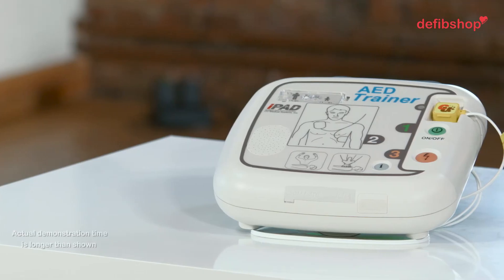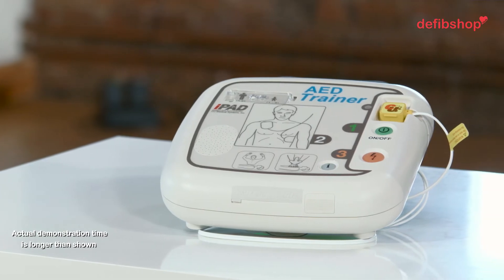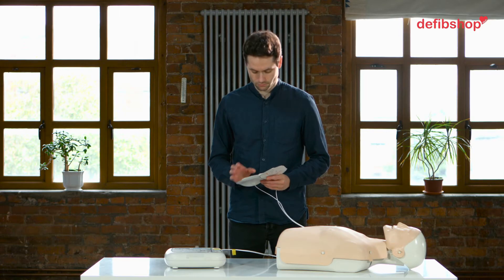This is a training unit, but here's how you'd use it in an emergency situation. Call emergency medical services now. Take out the pads from the bottom of the device. Tear open the pads packaging.